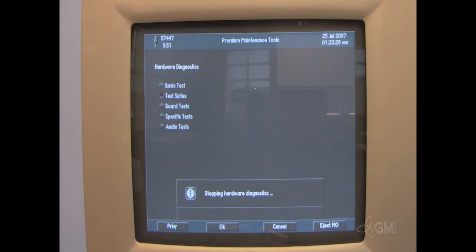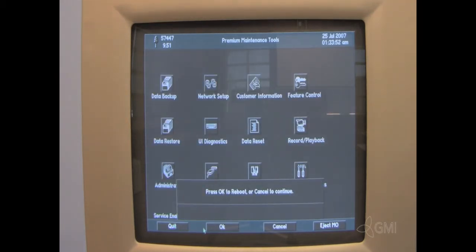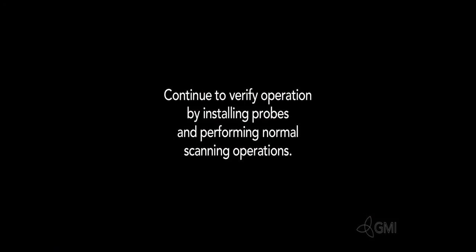Select Prior once more. This will start the hardware diagnostics. Select Quit. The system will then restart. Continue verification by installing probes and performing normal operations.